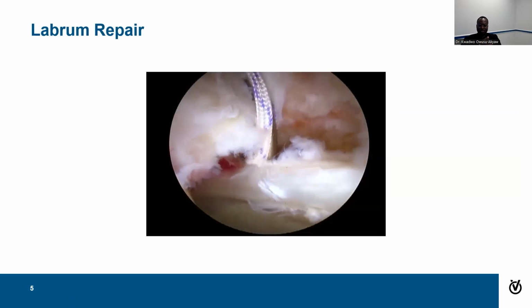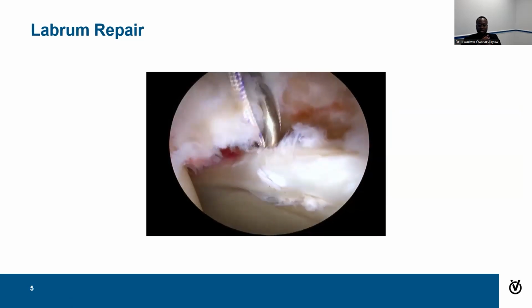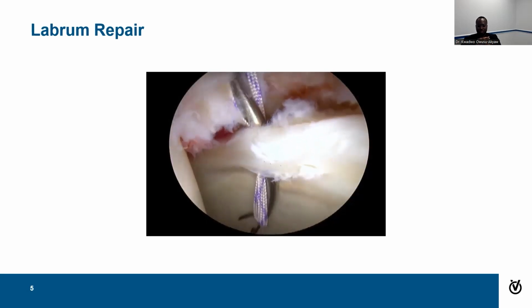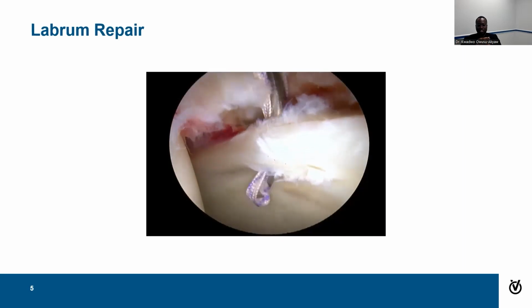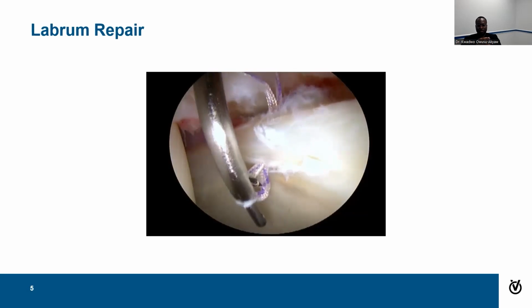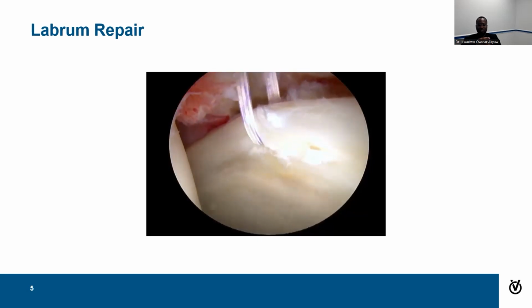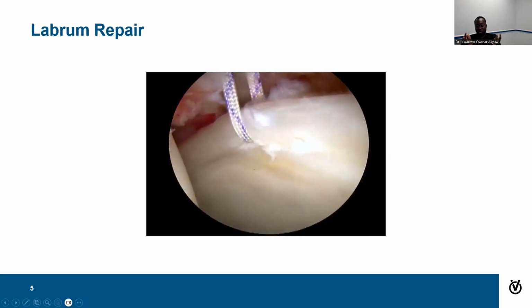So right now we have the labrum there, and I have what's called a suture passer, kind of a sharp hook that helps me push that stitch to go around the labrum. So here I am putting it around it. First I put it through, then I bring my instrument back out and around. I go back and grab it, and now I have it going all the way around the labrum. And that's how we start with just one stitch, and we just do that multiple times. We go to the next slide.